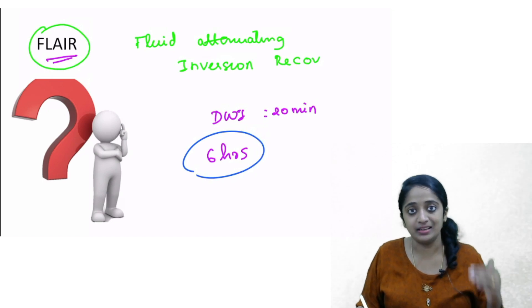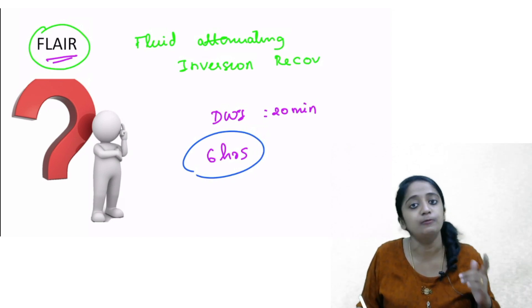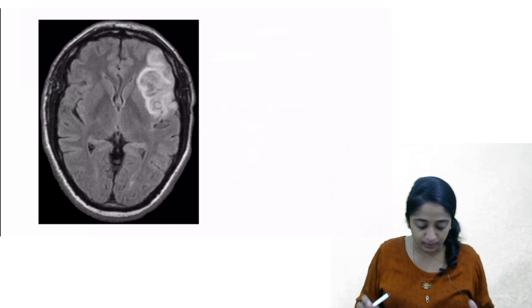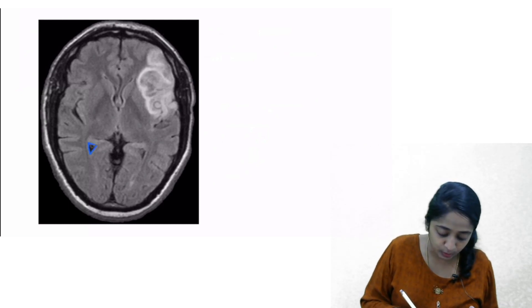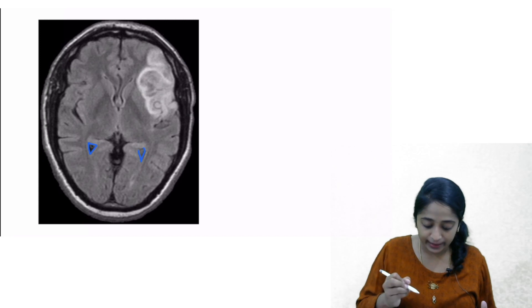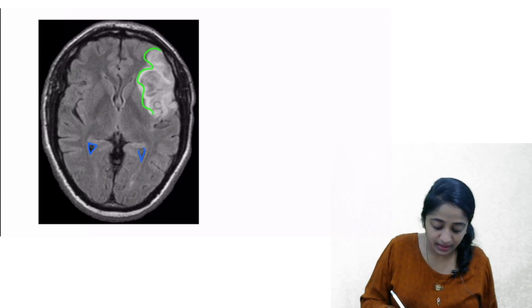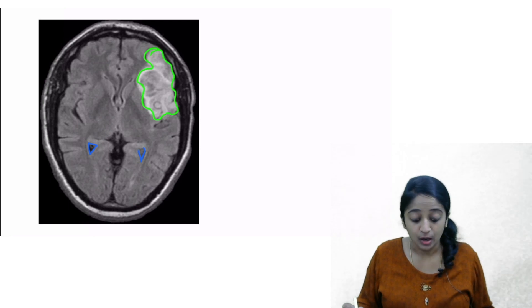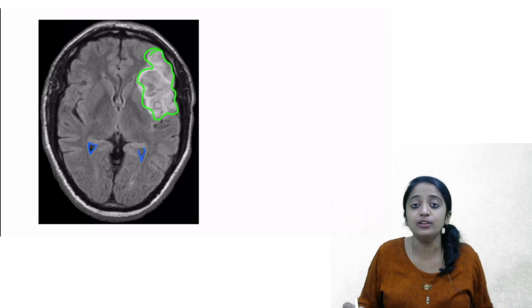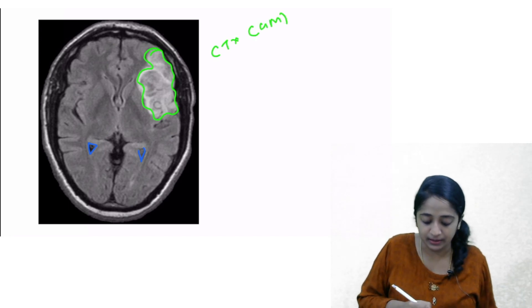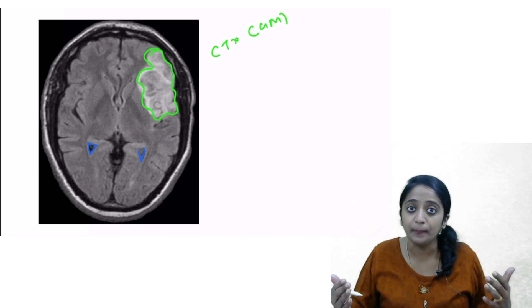Now let's see what you're going to look for in the FLAIR sequence. Here is a FLAIR image. You can see that the fluid signal within the ventricle — CSF — is suppressed. If you look carefully, you can see hyperintensity involving the left side of the brain parenchyma, specifically the cortex as well as the white matter, following a territorial pattern.